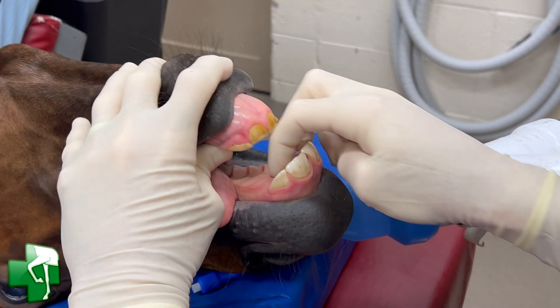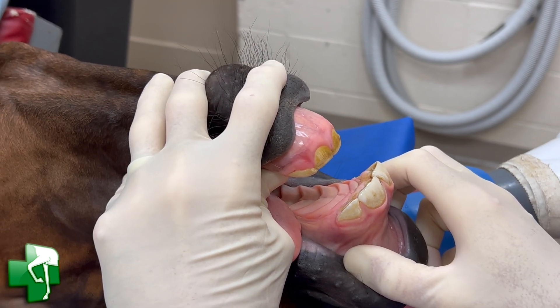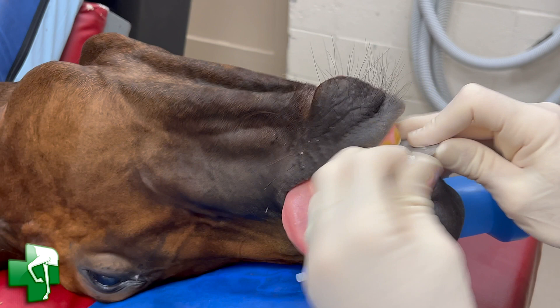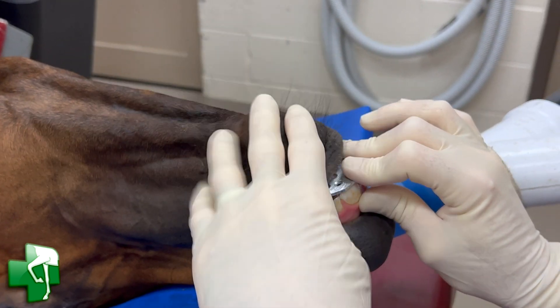You can see how we're coming into contact with the palate — not ideal. Nobody wants to bite and chew their tongue, bite and chew their lip, or certainly bite and chew their palate. So we're going to put something in here made of aluminum, covered in acrylic and fresh material, so this horse can bite in the correct place.